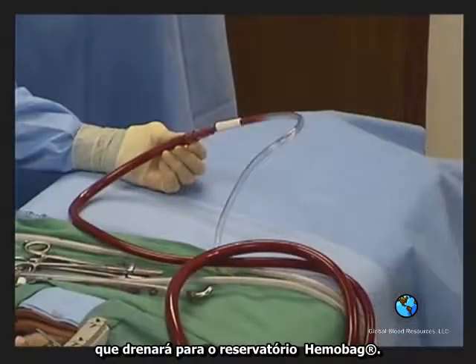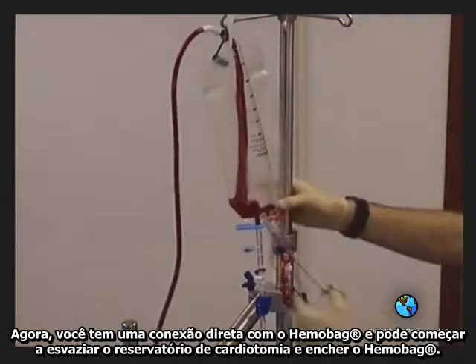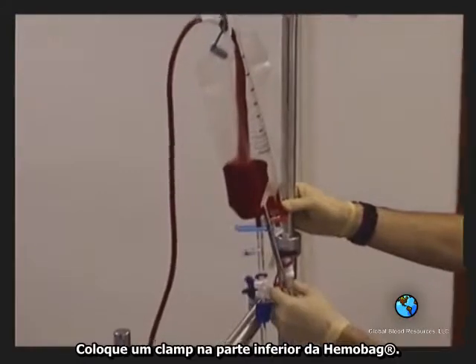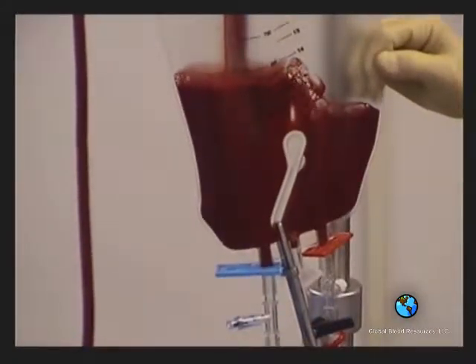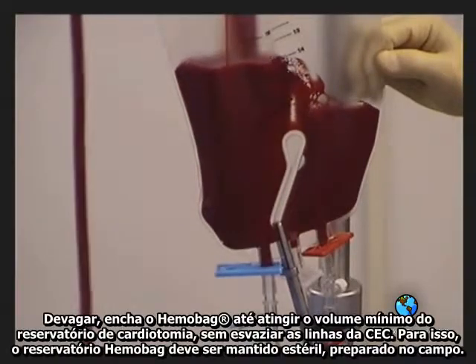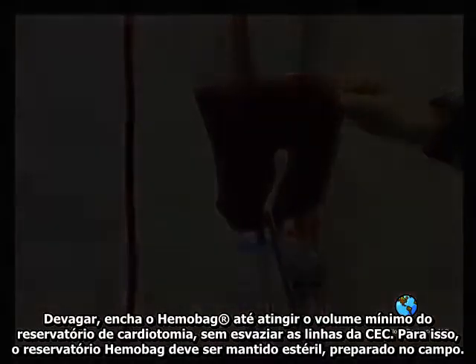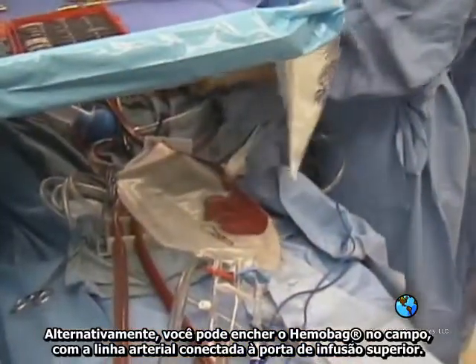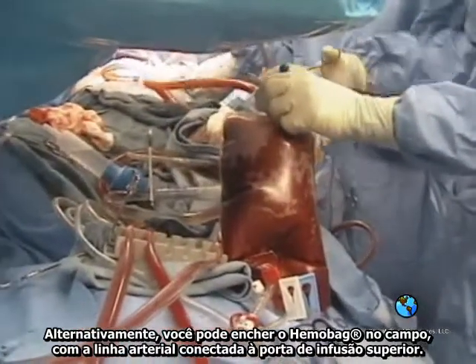Now you have a direct connection to the hemobag and can begin chasing the venous reservoir and circuit to the hemobag. Be sure to place a tubing clamp from the bottom of the hemobag up to the base of the baffle. Slowly fill the hemobag till you get to the bottom of the venous reservoir. Alternatively, you can fill the hemobag in the field with the arterial line connected to the top infusion port.